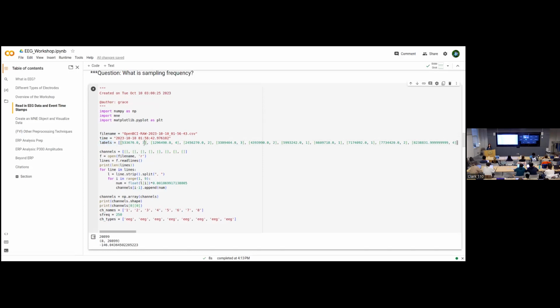And then this number 3, the second entry for each of the 100 data points in this labels variable, is an array index for the card that was shown. In this case, I don't remember what 3 was, but it corresponds to a specific poker card.